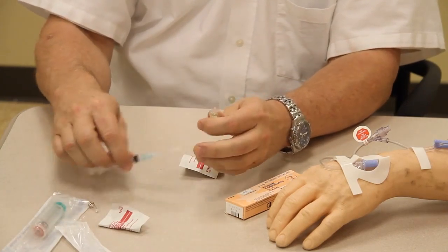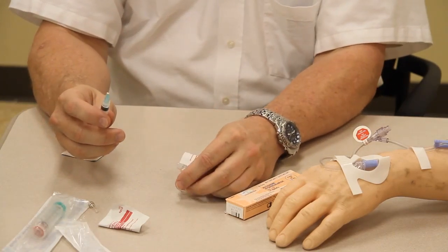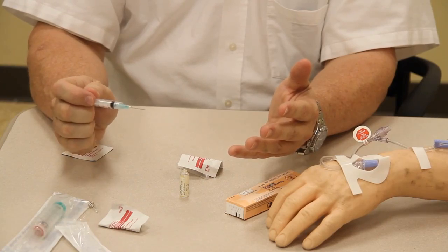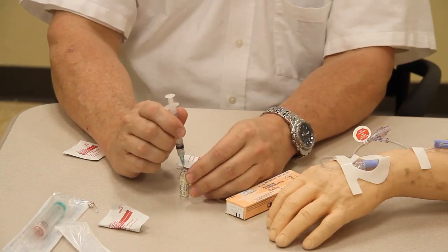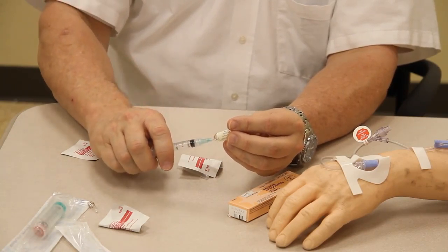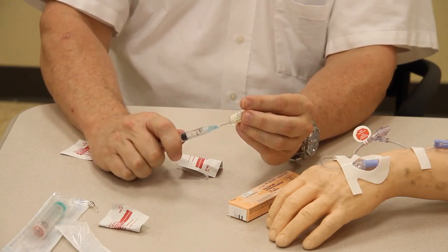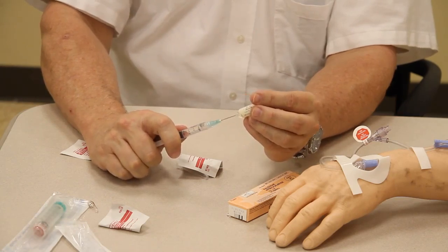We're going to bring that back over. We're going to take the syringe and needle. Okay. Now what we want to do is make sure that we're not putting our hands in danger when we start talking about taking medication from this vial. So now I'm going to lay the vial down, and then I'm going to penetrate the vial. I'm going to bring it up, twist it downward, and start drawing the medication in.